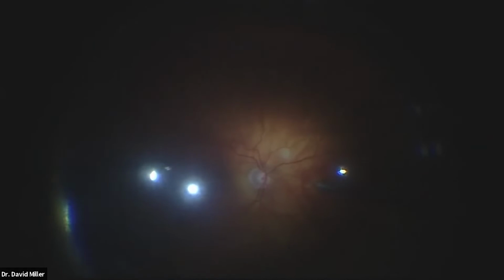I think we're in pretty good shape. So that's about all it's going to take. And we'll drain the fluid. You see the fluid reaccumulated again back here while we were doing that. So we're going to take that fluid out again. And then we're going to put a gas bubble in.